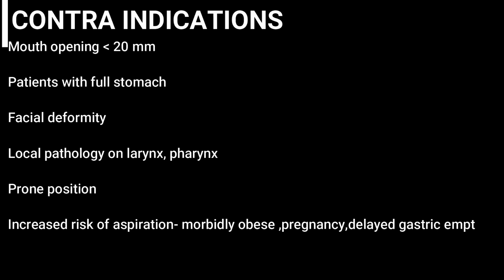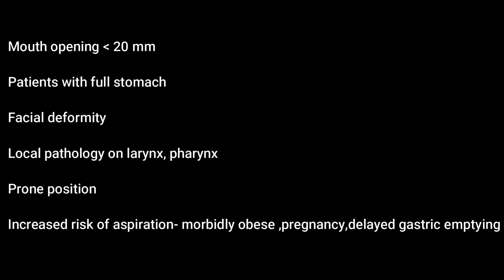Contraindications. It is contraindicated in patients whose mouth opening is less than 20 mm, in patients with a full stomach, in patients with facial deformity, in local pathology of the larynx or pharynx, in prone position, and in increased risk of aspiration, as in the morbidly obese, in pregnancy, and in patients with delayed gastric emptying.